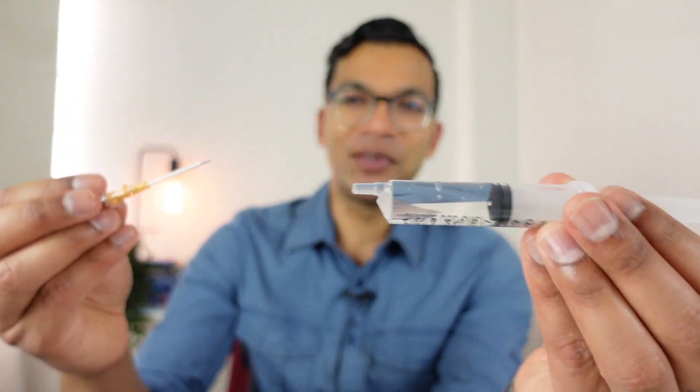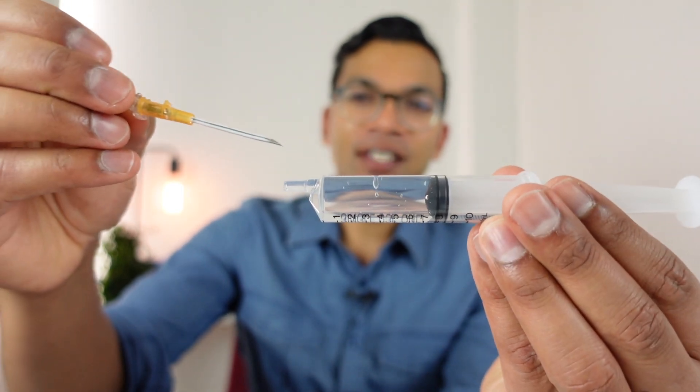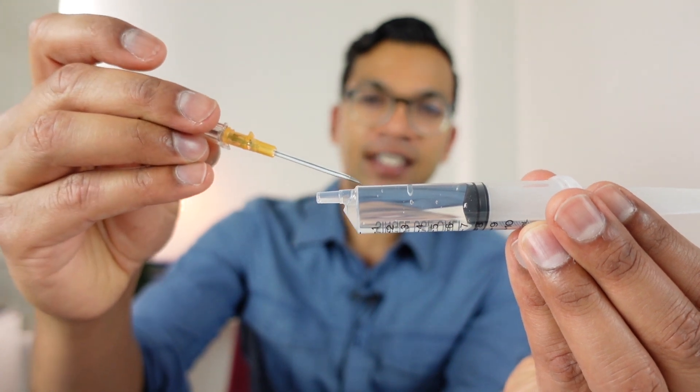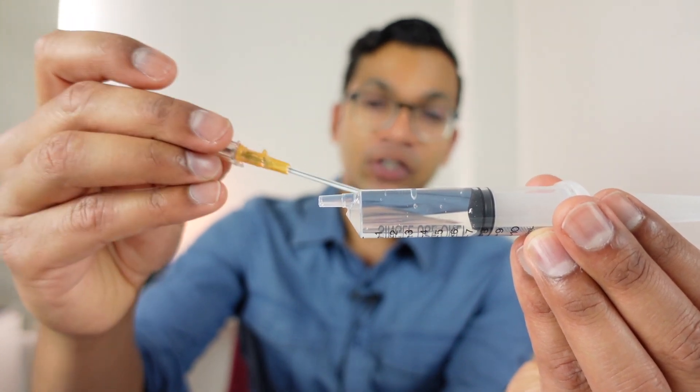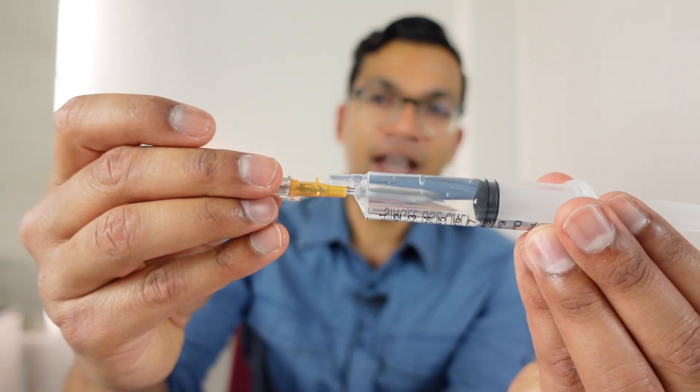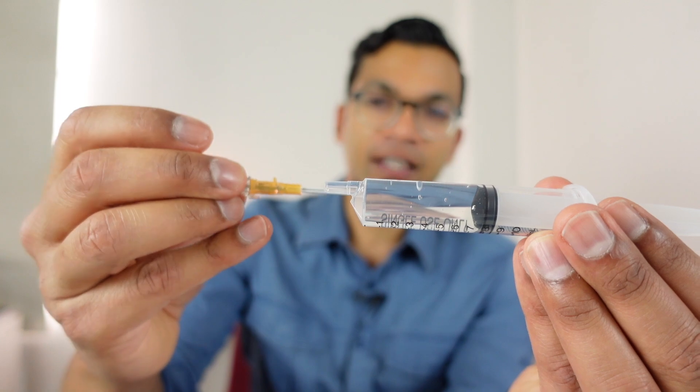Flashback is absolutely vital. It's the only indication - without other fancy techniques like ultrasound - that your needle and cannula is actually in the vein. What I mean is: you've got your needle, and imagine that this syringe is a vein. You go through the skin and you don't get any blood in the chamber until you actually enter the vein itself. Once you're in the vein, you know your needle's there, which is why you lower the angle and advance before pushing off the cannula. Flashback is the first and only indication your needle is inside the vein.